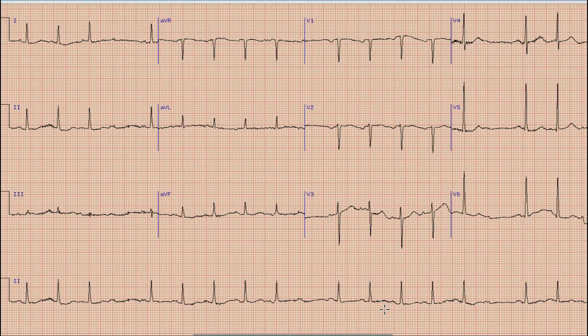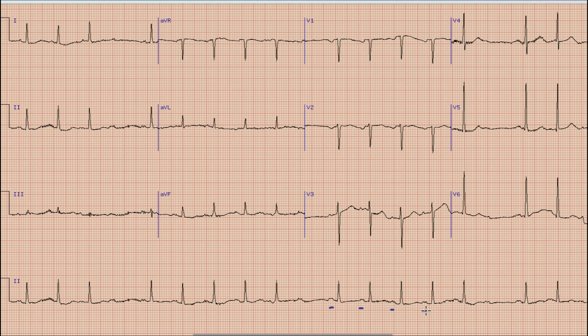Starting with the discussion on this ECG — as you know, the first step is to look for the presence of upright P waves before each QRS complex in the rhythm strip. We can find here that there is an upright P wave before each QRS complex in the rhythm strip, so it implies that this is a sinus rhythm.